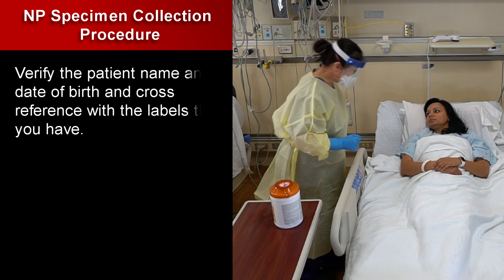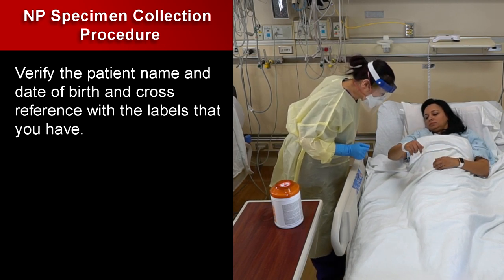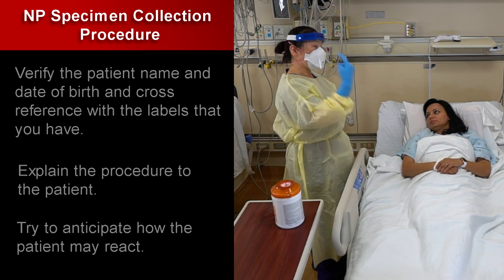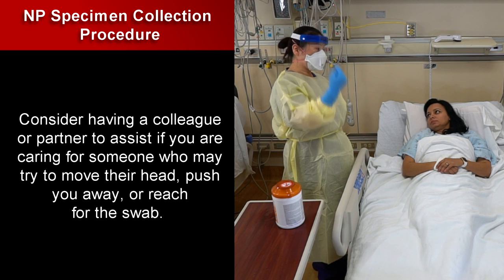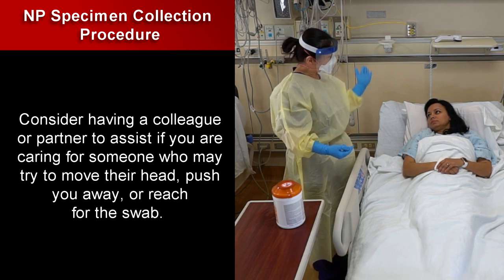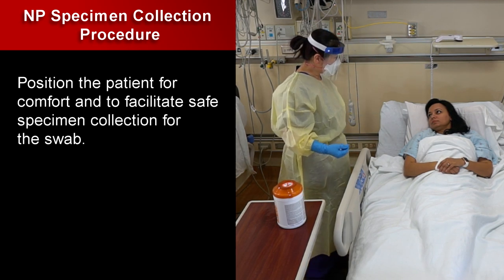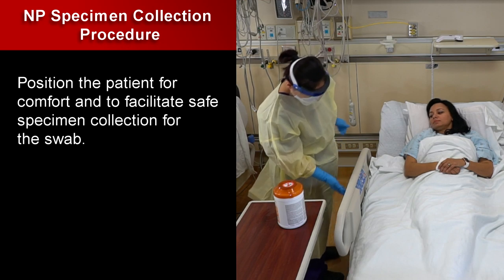Verify the patient name and date of birth and cross-reference with the labels that you have. Explain the procedure to the patient and try to anticipate how they may react. Consider having a colleague or partner to assist if you are caring for someone who may try to move their head, push you away, or reach for the swab, such as a pediatric patient.